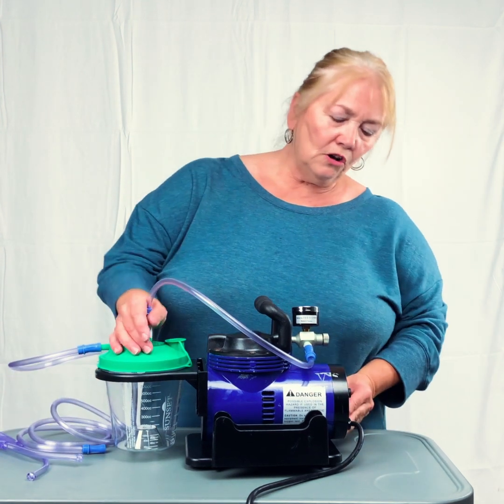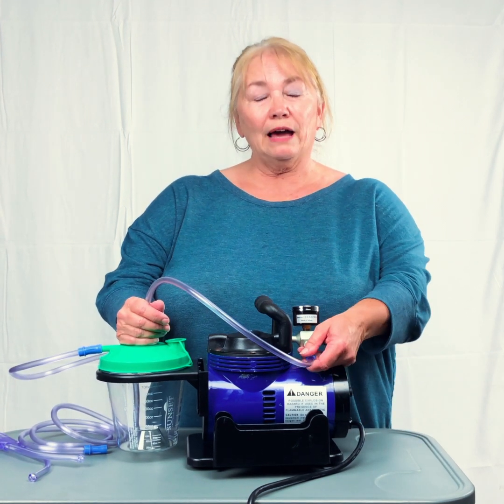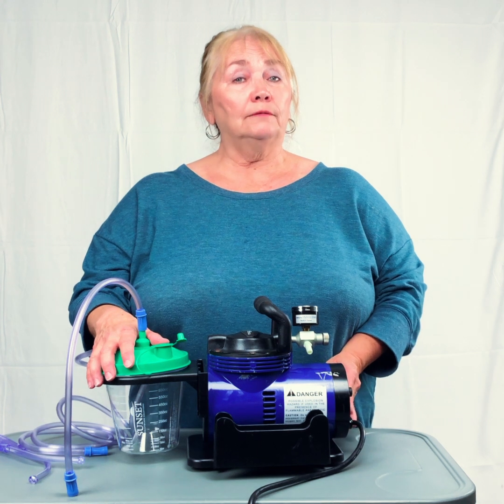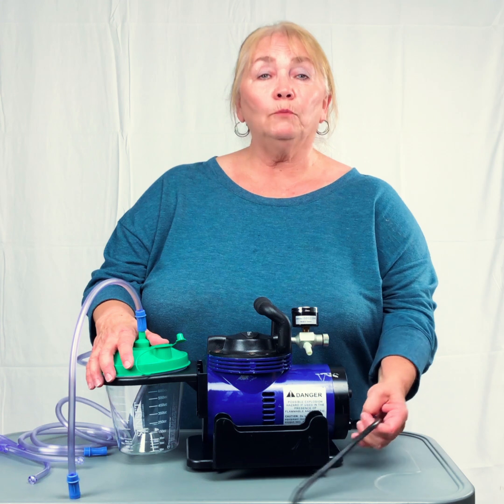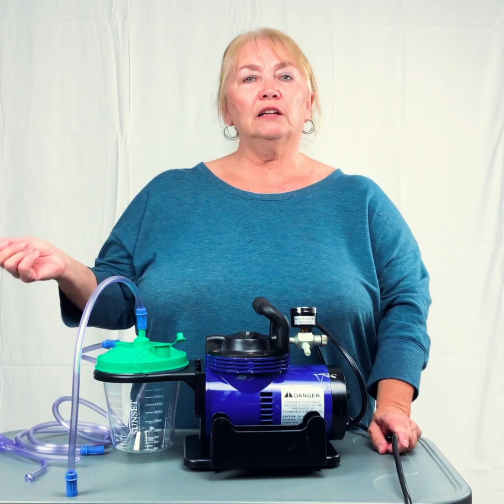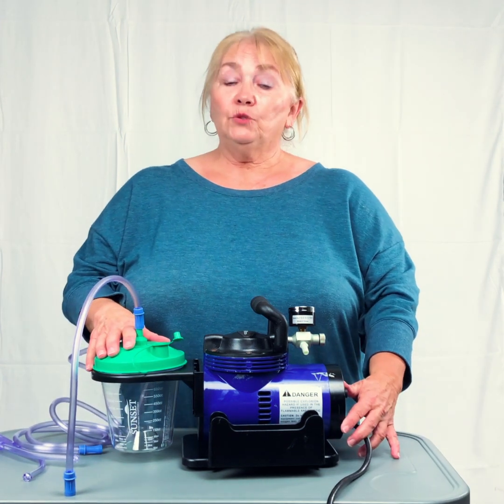Now a lot of times we get a phone call, the suction machine isn't working. Those calls a lot of times get routed to me. So first of all, I'll say, does it turn on? It either will or it won't. If it does not come on, I'm going to ask you to plug it into a different outlet. Sometimes we don't think about the fact that the plug is plugged into an outlet that gets turned off when the light switch is turned off. So that's one of the reasons why we say plug it into a different outlet.